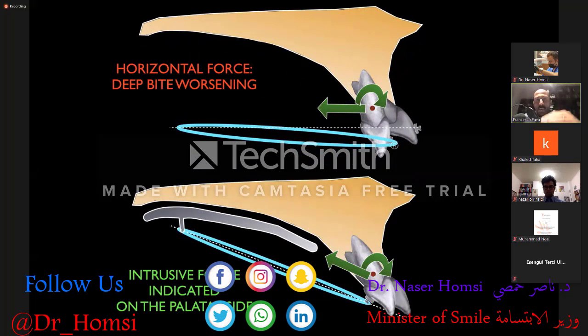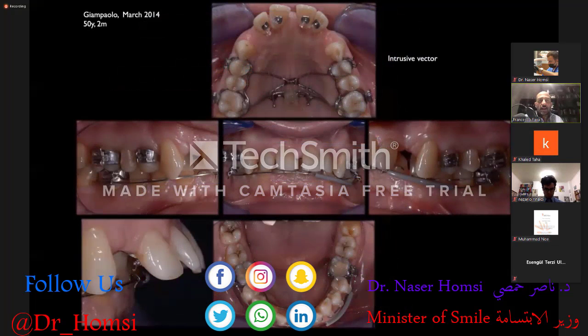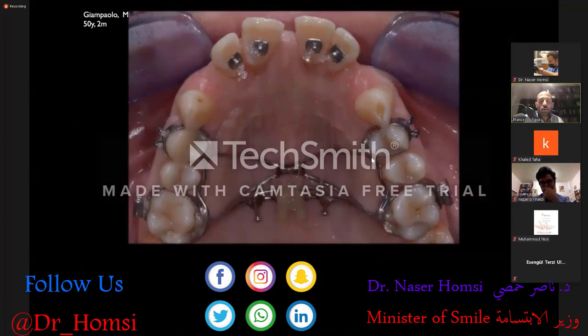Before going on, I would like to share once more with you the biomechanical scheme, why it's quite dangerous in this case to use a horizontal force, because it would tend to generate a deep bite worsening, and why in this case an intrusive force on the palatal side is indicated in order to maintain the good vertical position of the upper incisors. Let's go back to Paolo, and let's go back to his appliance.